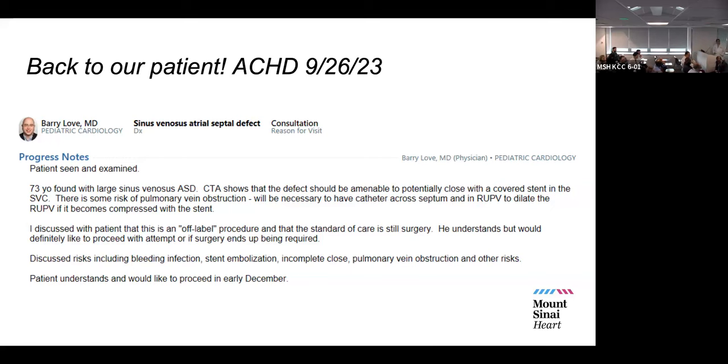That's number one. Number two is that this patient is very lucky in the sense that even though he has a high shunt, his RV is not so dilated that his tricuspid annulus on the right side is compromised. He doesn't have severe TR, and his liver is protected. Right. Mild, but it could have been severe, and his liver is protected. Right. So overall, his end organs will be fine.